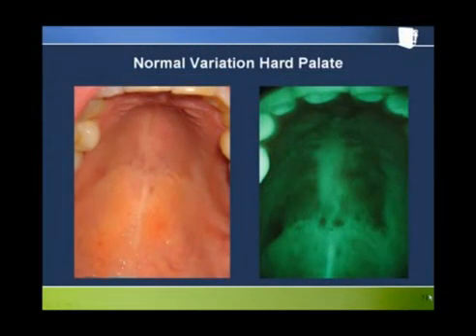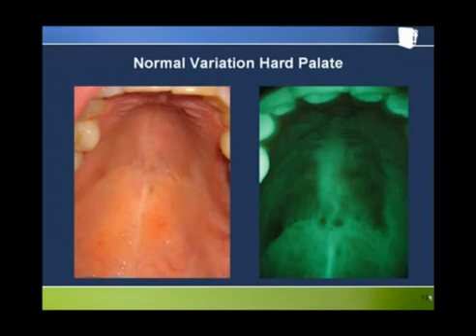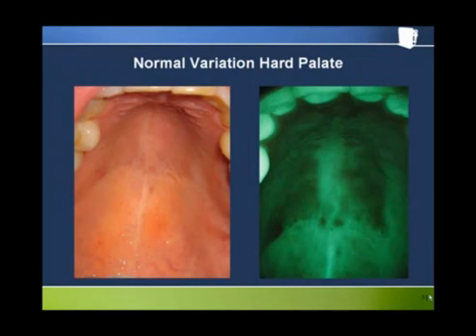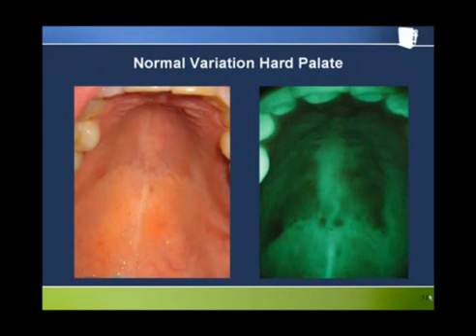This is another interesting presentation of a normal variation that can be seen in white light and fluorescence visualization of the hard palate. The bilateral presentation is a good sign that this is some sort of benign variation. The darker red appearance of the hard palate under white light and the pronounced darkness through the Velscope seem to suggest that the tissue has become hypervascularized, perhaps in response to oral habits or as a result of anatomical variation.